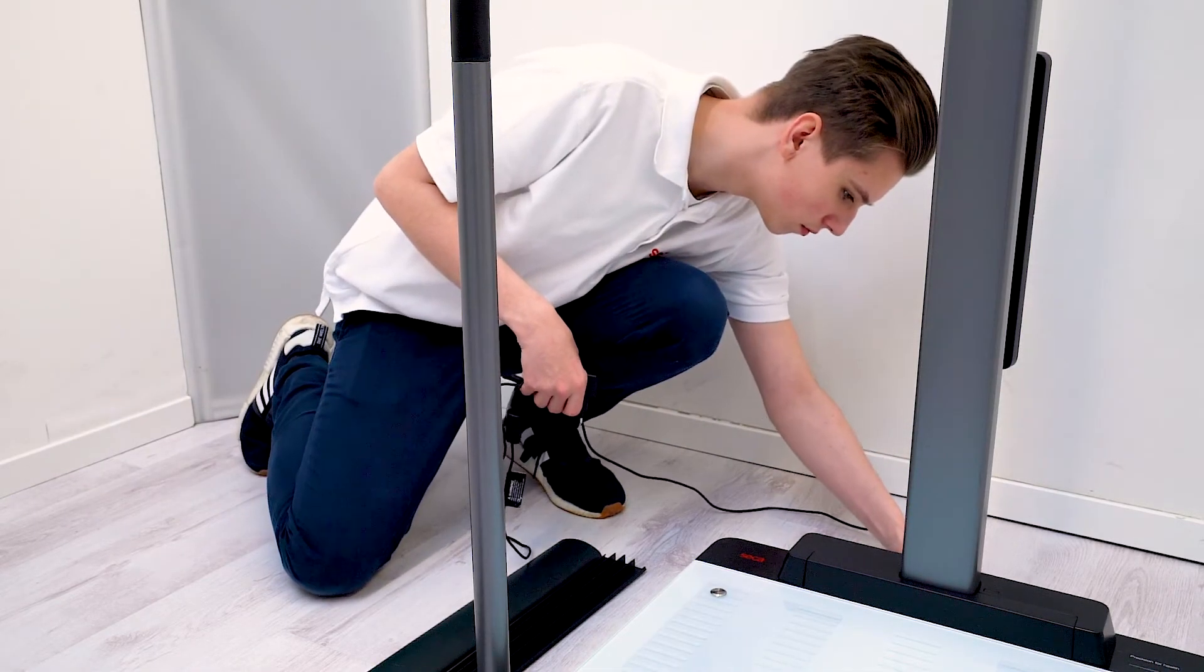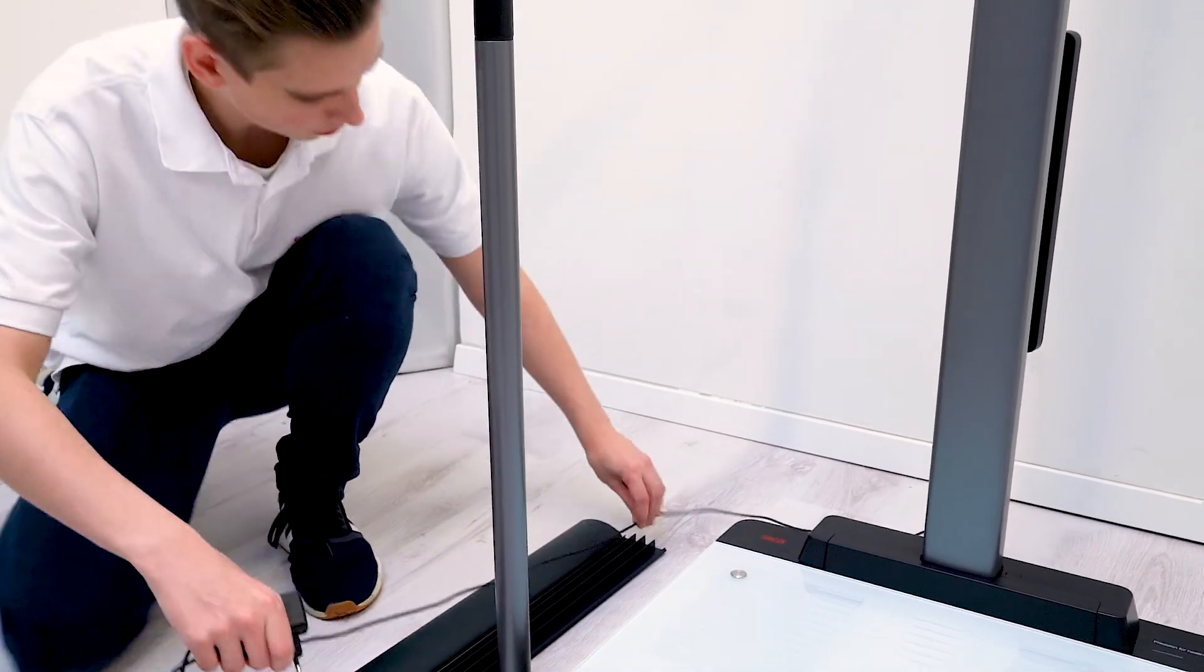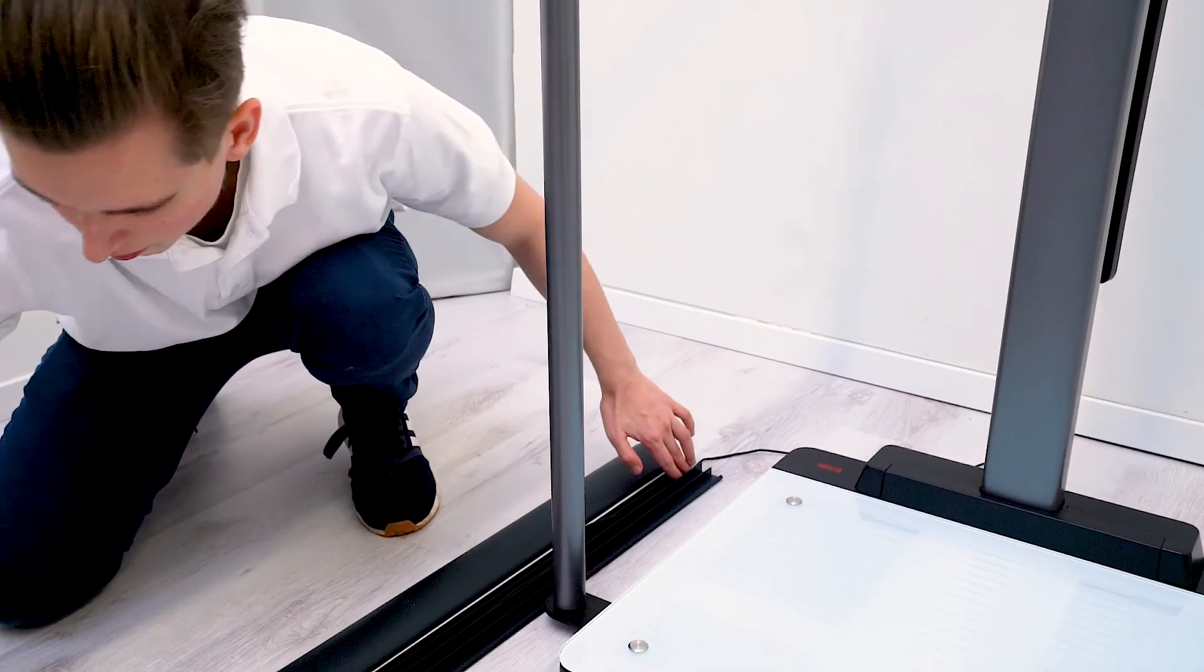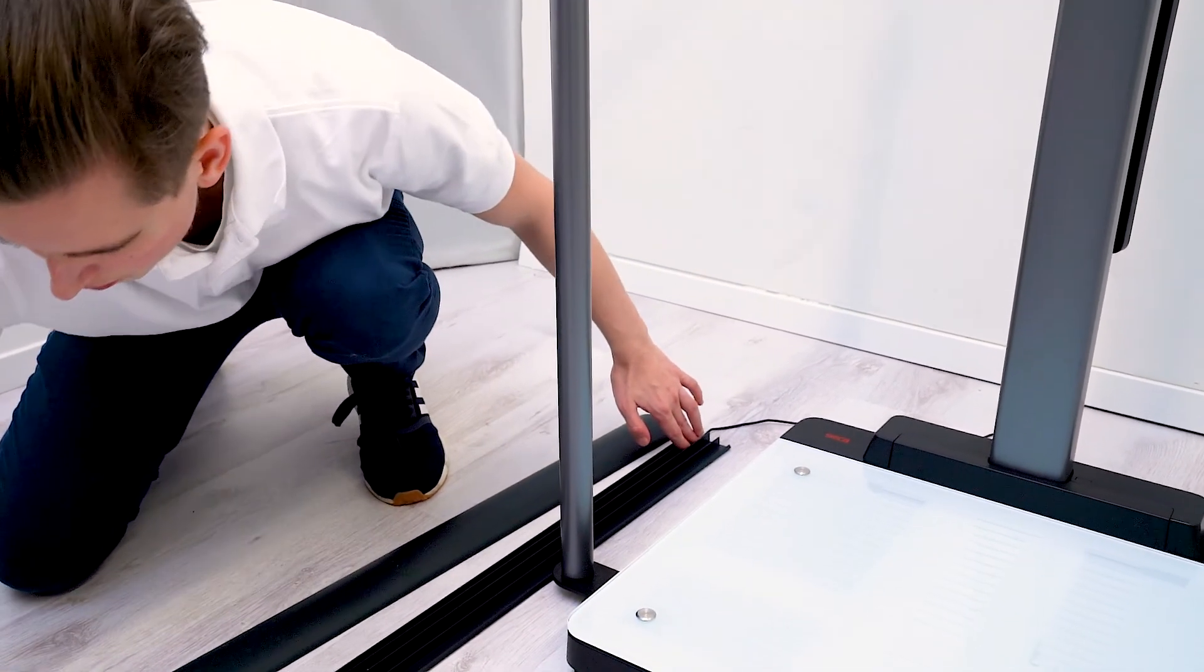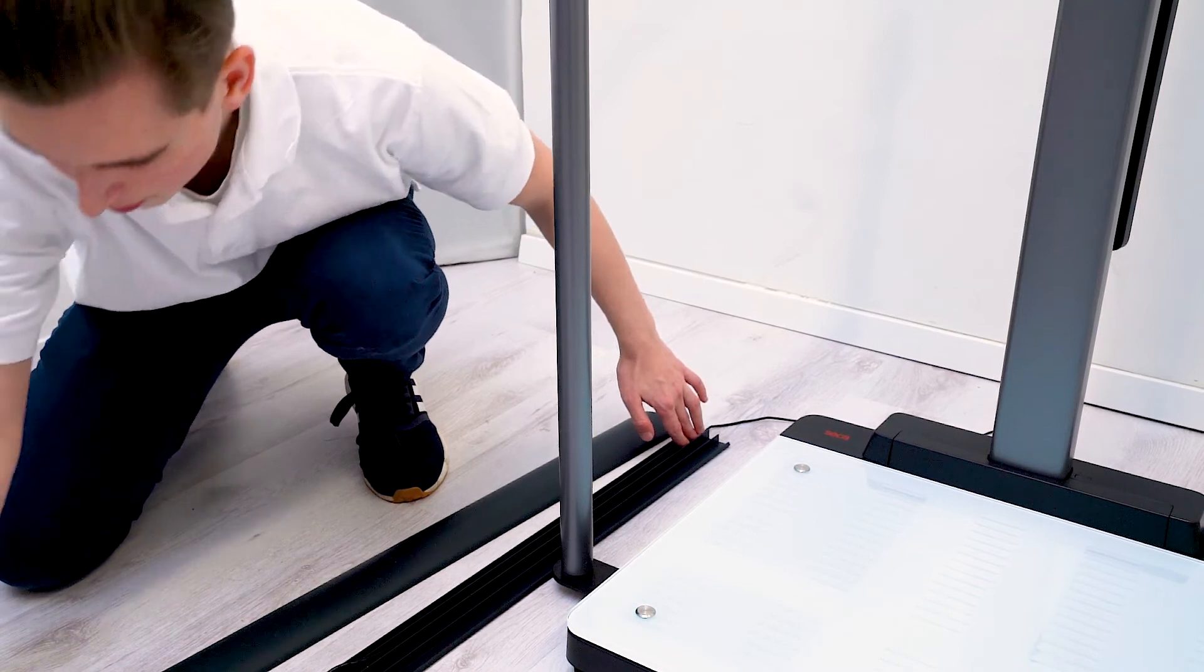The cable must not become a tripping hazard. Route it in such a way that no one has to cross it or, if necessary, secure it with a cable crossover.